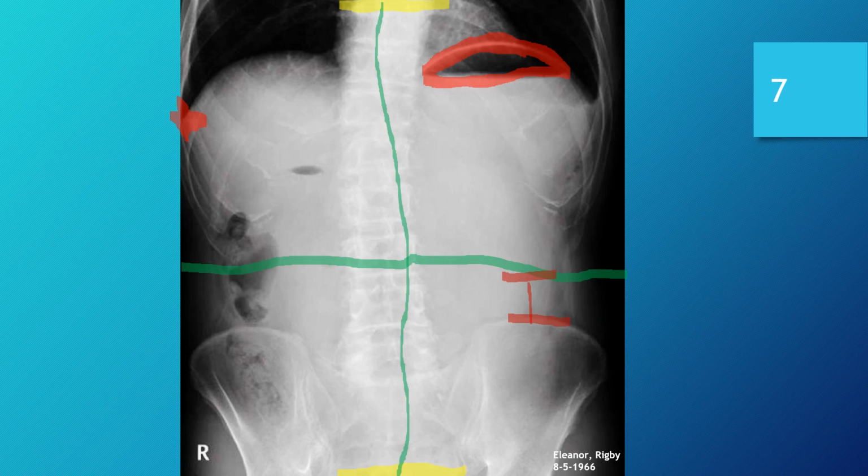Looking at the lung fields, noting how dark those areas are, as well as taking a look at the rest of the patient's abdomen, with the exception of a bit of bowel gas here on the right side, as well as perhaps a small portion there, and then the stomach, there's very little to discern about the rest of this patient's belly. And that is quite possibly due to the image being underpenetrated.